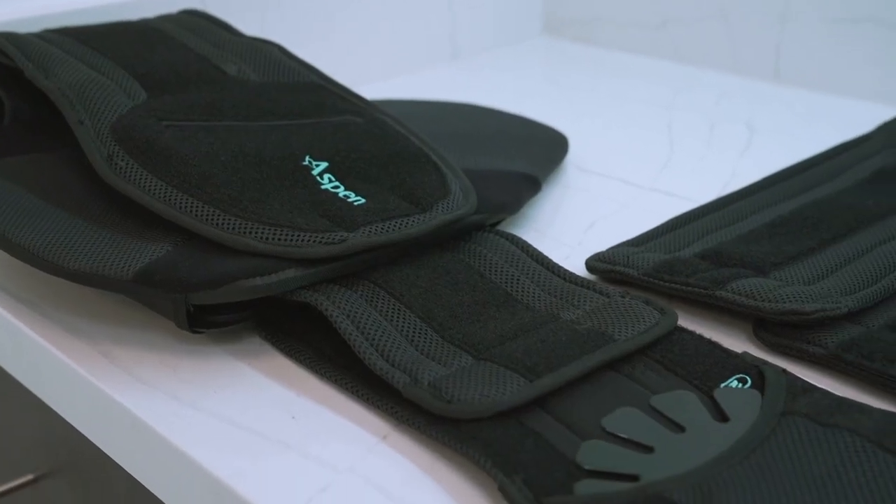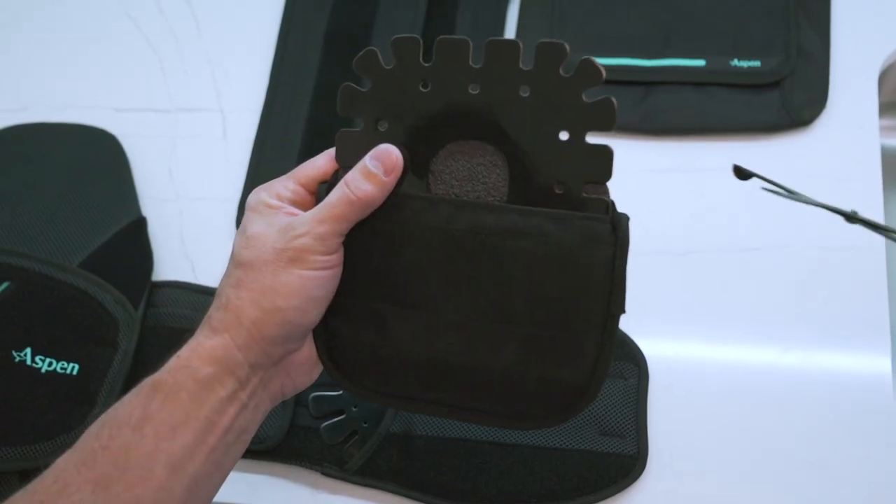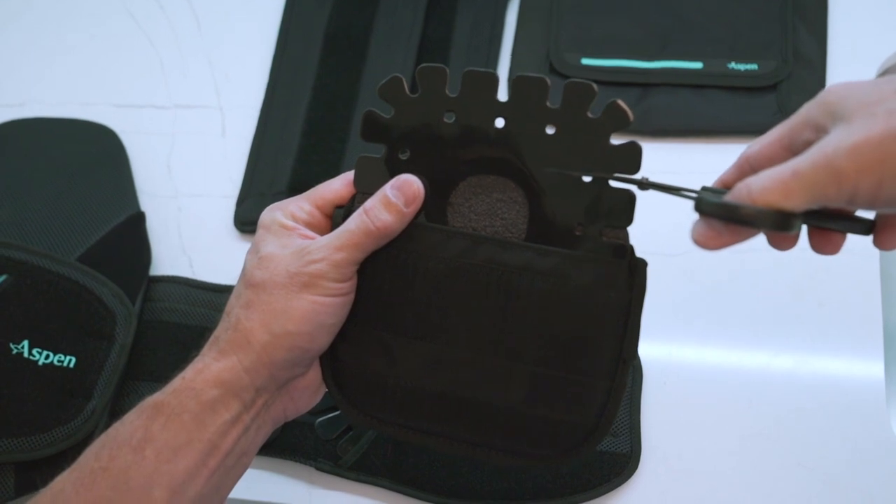If customization is required, Horizon Pro's anterior, lateral, and posterior panels can be easily accessed and trimmed or heat molded.